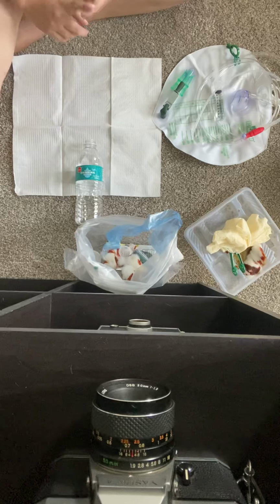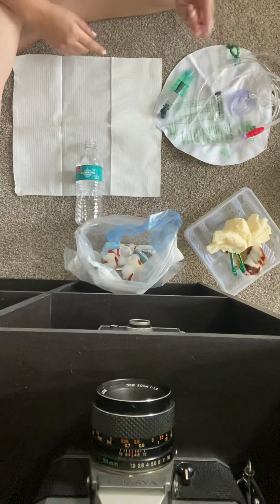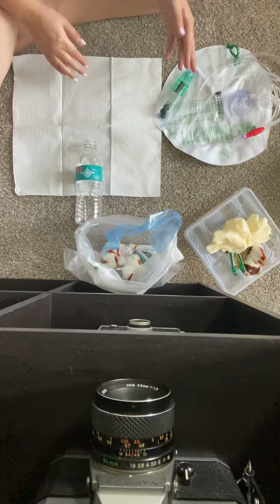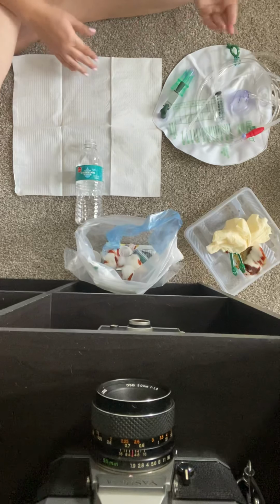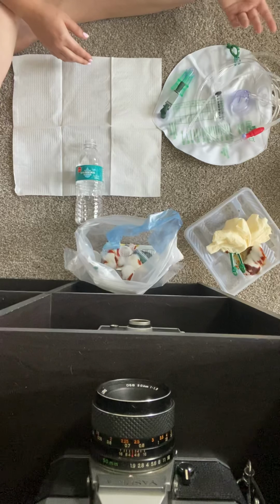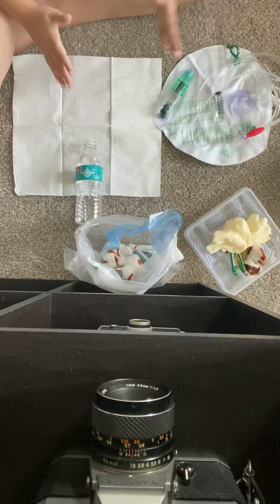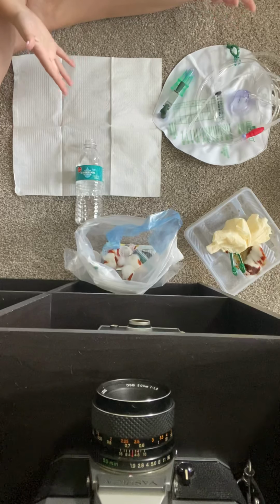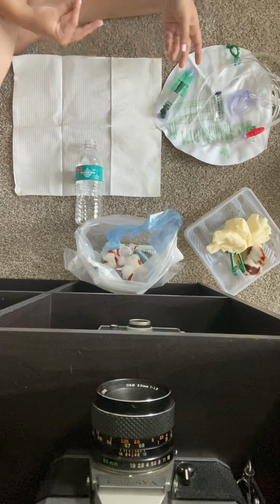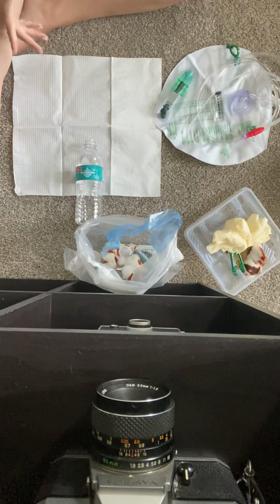So I want to document the time that I removed it and the amount that I pulled out from the balloon, so the 10 cc's. If you're unsure, let's say you only got out 9 cc's, you could check the charting of the person that inserted it, because you should be charting that. So if they only filled it 8 cc's and you can only get 8 cc's out, and nothing else is coming out, you can check your charting and see, okay, they only put 8 cc's in, so I'm only expecting 8 cc's out. That's kind of nice when you do chart that, and you should be charting that.